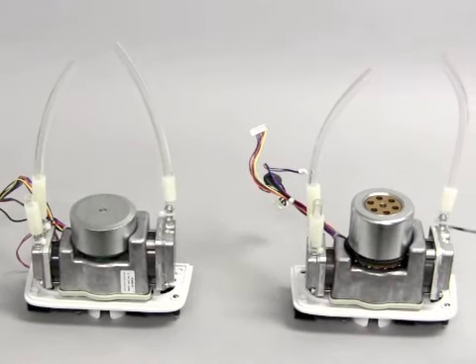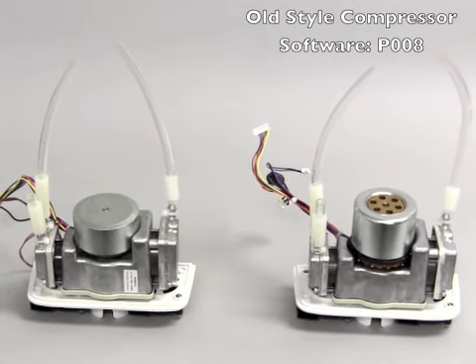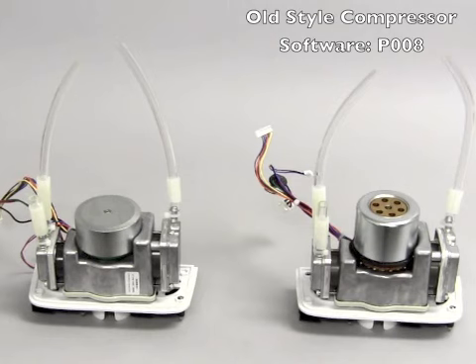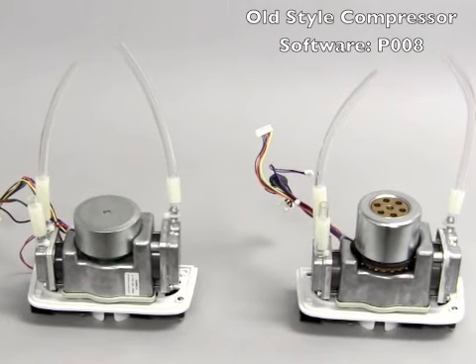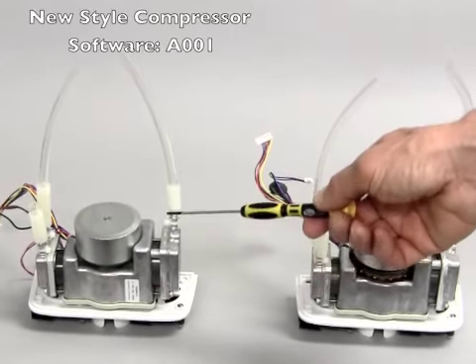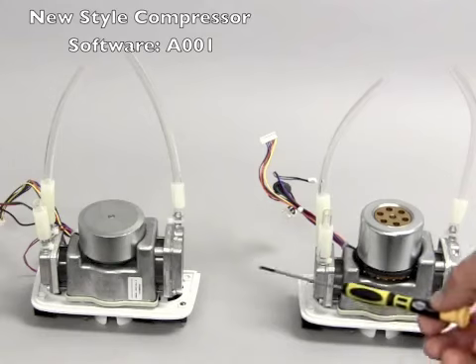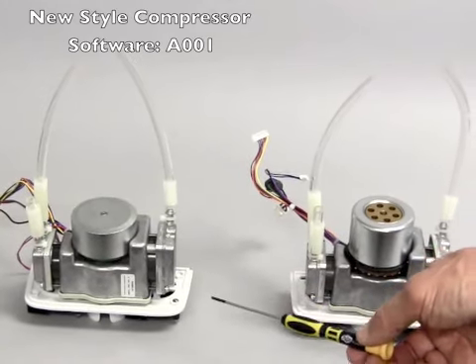This is important to mention in that the old style uses software P008. So when you turn on your POC and you look at the software on the board, the old style compressor uses P008. To run the new compressor, the new style, the board has to have software in it A001. Again, this is critical that when you have a new compressor, you use A001 software for the board.